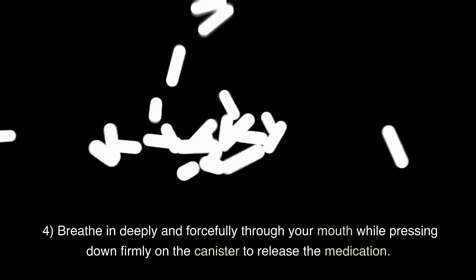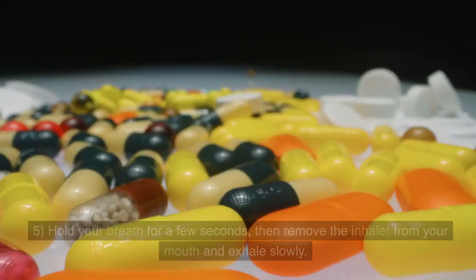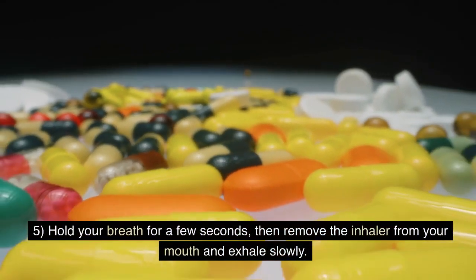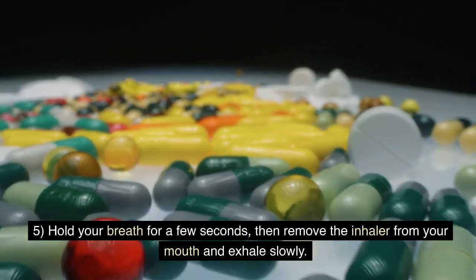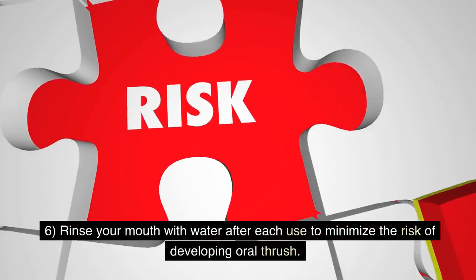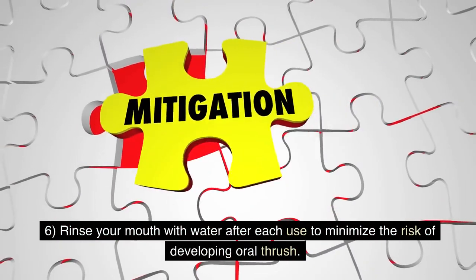4. Breathe in deeply and forcefully through your mouth while pressing down firmly on the canister to release the medication. 5. Hold your breath for a few seconds, then remove the inhaler from your mouth and exhale slowly. 6. Rinse your mouth with water after each use to minimize the risk of developing oral thrush.